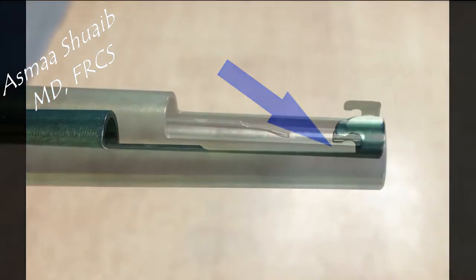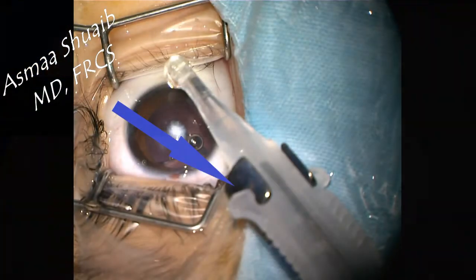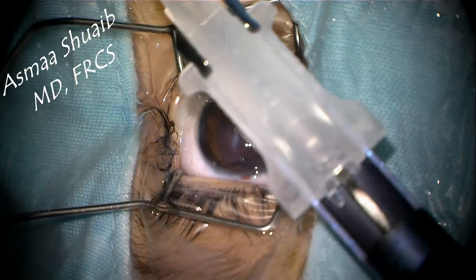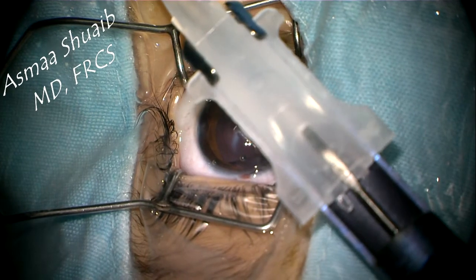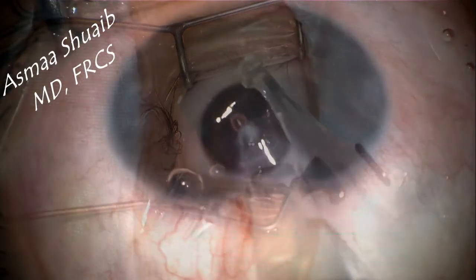Alcon's cartridge is compatible with this injector. The wings of the cartridge are pushed into the groove until a click is heard, then the IOL can be pushed by the plunger. But what will happen if you use a D cartridge with a three-piece IOL?